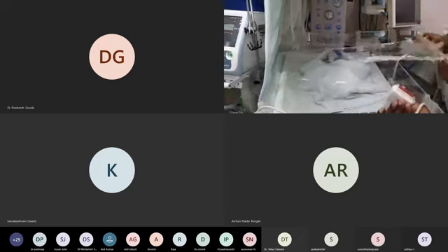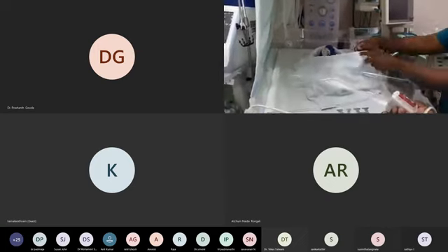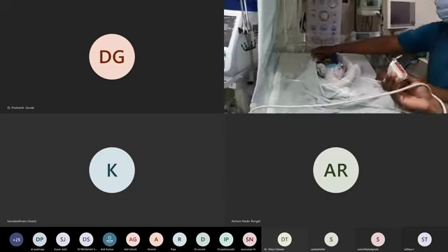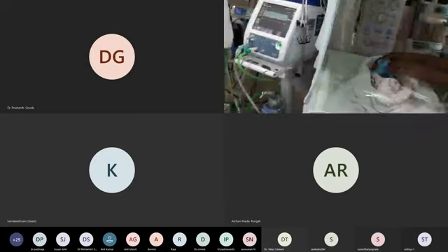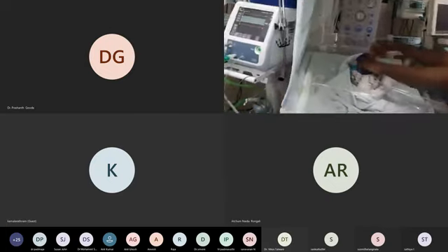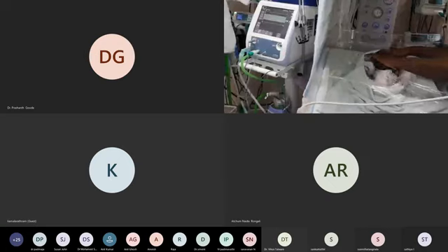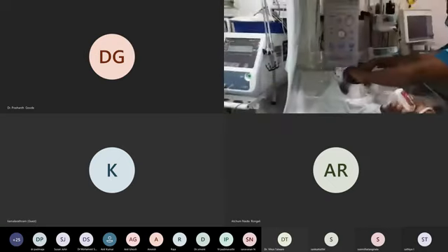I know some machines and incubators are very good. Okay, excellent. But we do use the warmer with the covering of the plastic. So please don't think any other way. Yeah, slowly remove. And remove the temperature probe also for 1 minute. Take your own time.